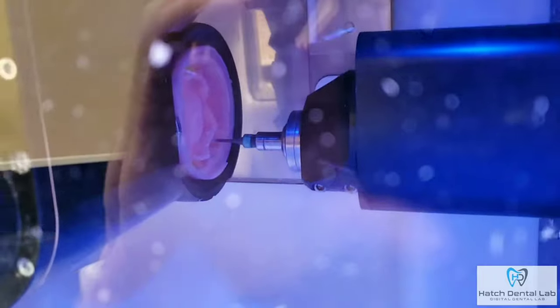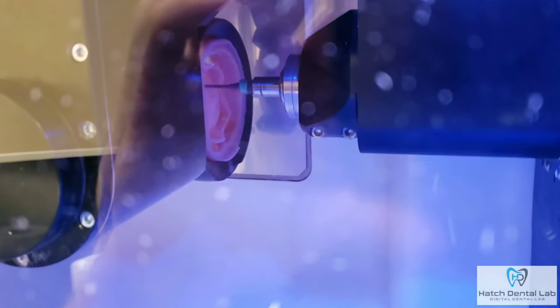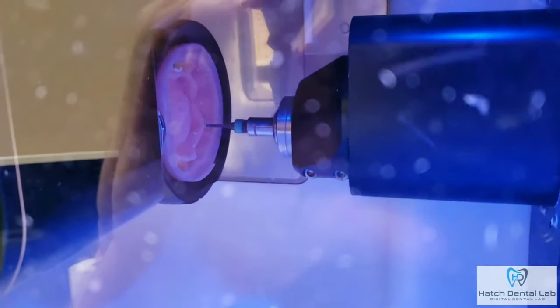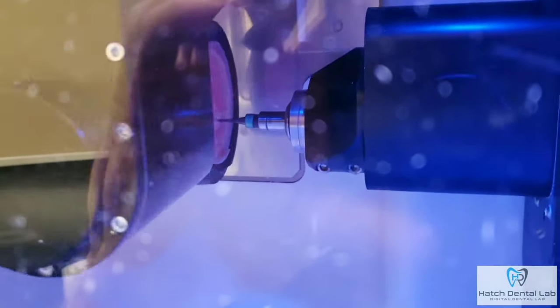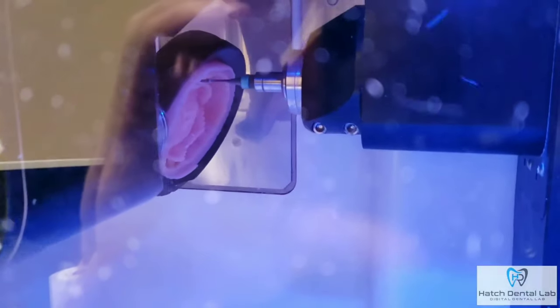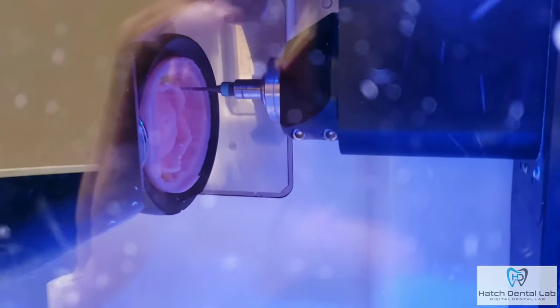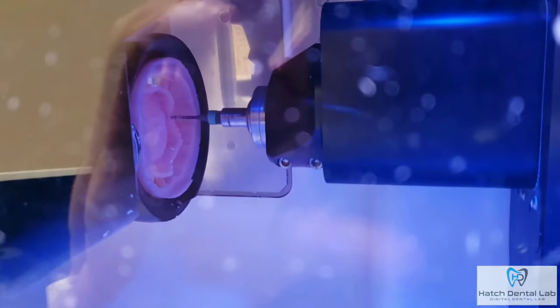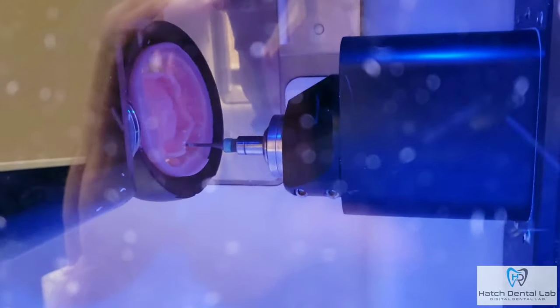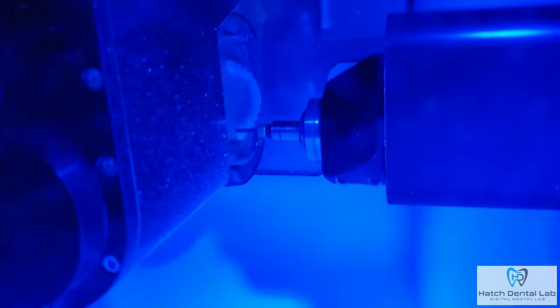Now that the teeth and base are bonded, they are sent back to the mill to get polished and perfected. You see here that a very small burr is doing the final detail of the milling process to make sure the denture comes out exactly as it was designed.